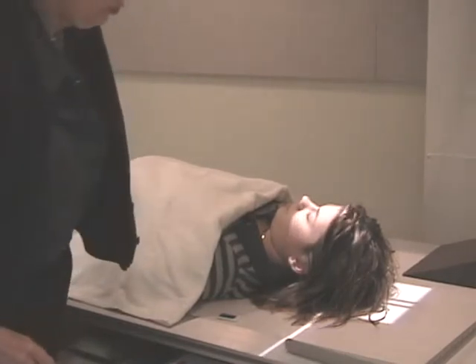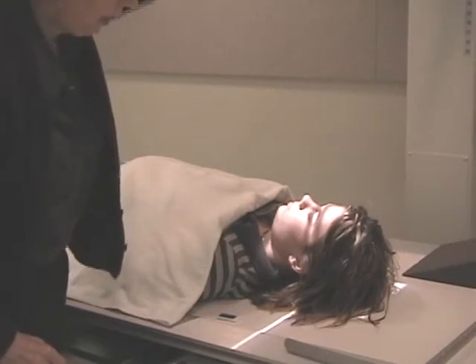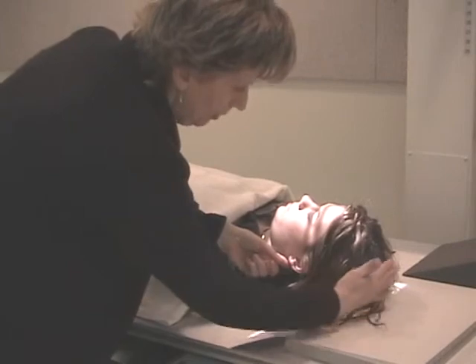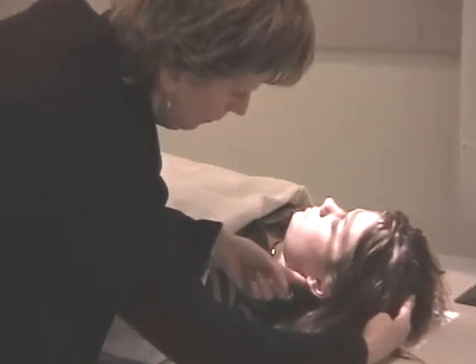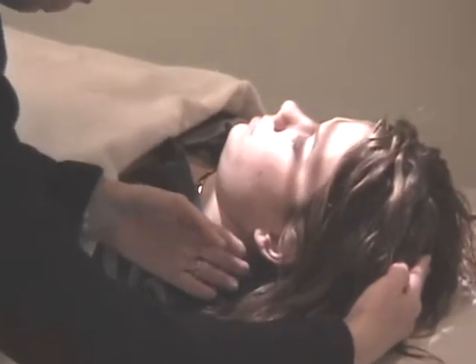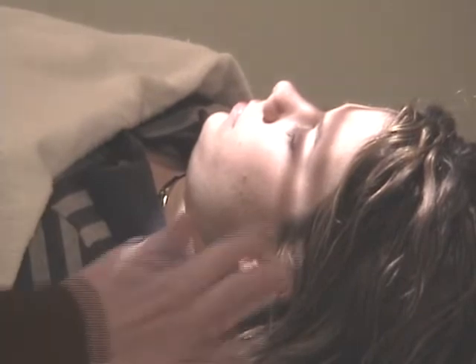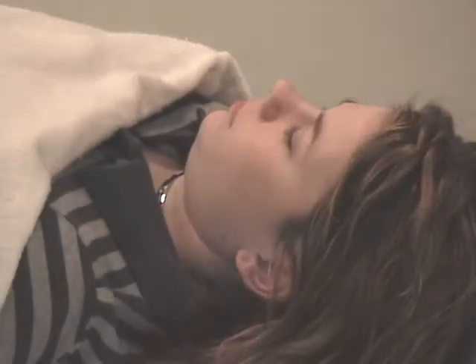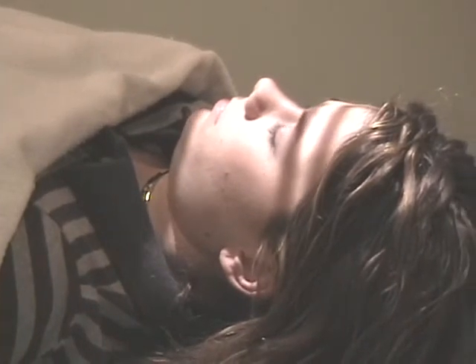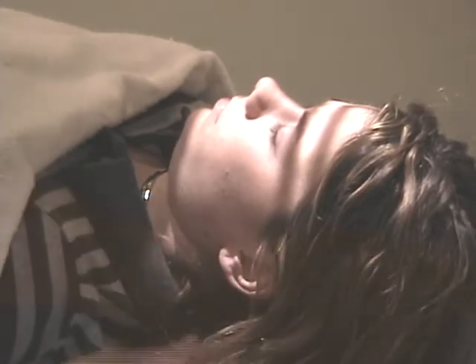I'm adjusting my tube to exit to the center of the film, and I'm analyzing this particular patient's skull shape. Here's the vertex. There's the bottom of the skull, and you can see that this crosshair is just a little bit low, and I like my skulls being centered. So instead of having the 2 inches above, I'm going to adjust that centering just a little bit to put the cranium right in the center of the film.